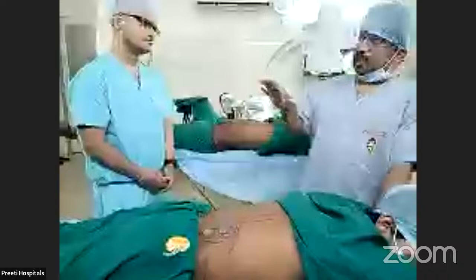In prone, you puncture the inferior calyxial stone, go to the pelvic stone, turn it, and then remove. If you cannot turn, you do a saline flush and then remove, or else you dilate and push it here and remove. In supine, you go through the middle calyx, remove this, turn here. If it doesn't come out, you make another puncture from the inferior. Ultimately, middle calyxial puncture and removal of stones is very good in supine PCNL.